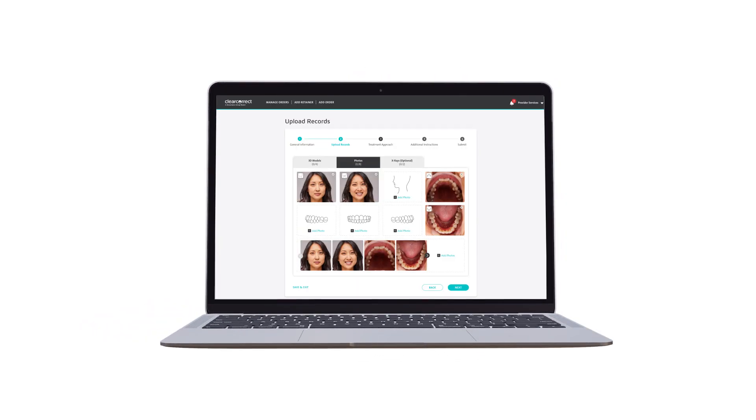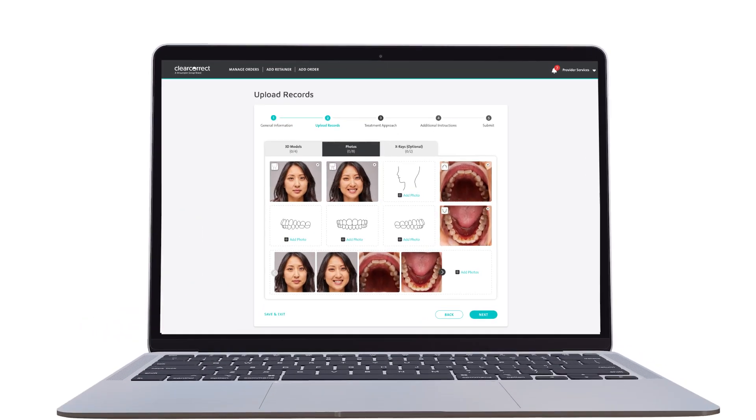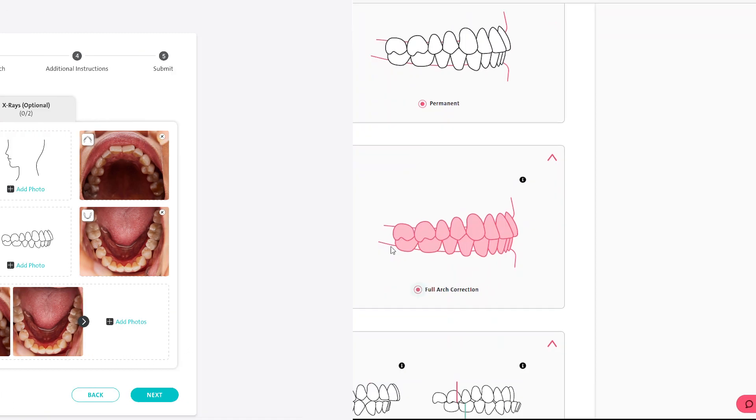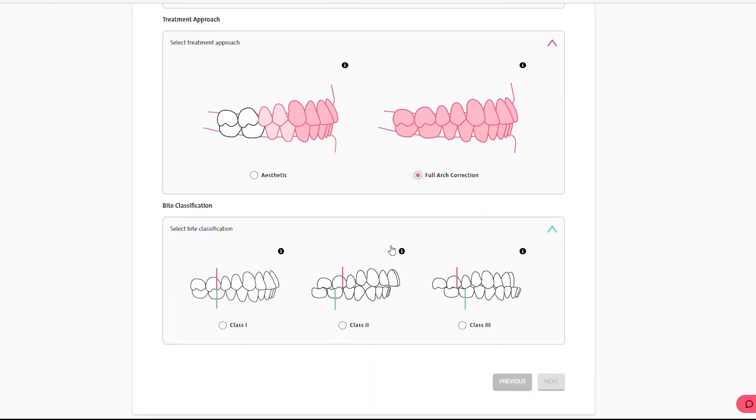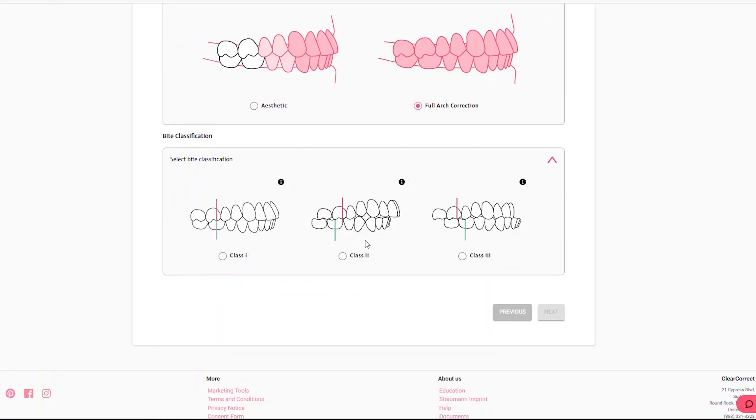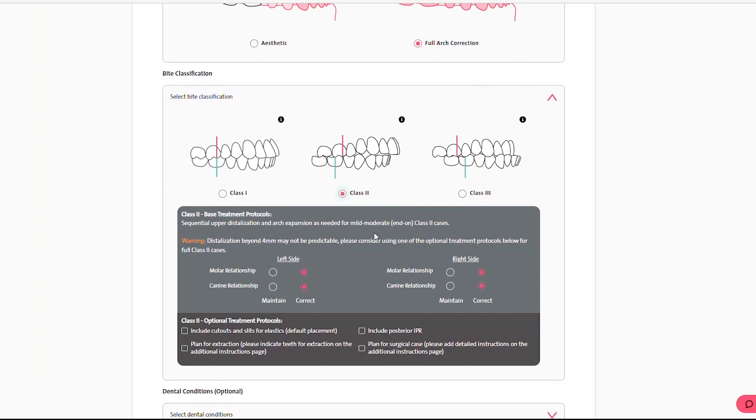Once in the doctor portal, you'll find a robust suite of features that extend beyond case management. Select your optimal treatment protocols with advanced customization options using our guided dynamic prescription form.